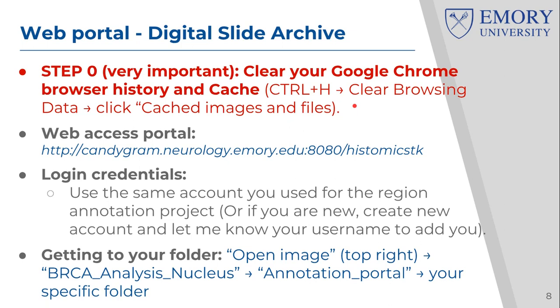The reason that is important is that, especially if you were with us during the previous version of this, the region annotation, then you will have annotation styles stored in your browser. You're going to have the old version of the Histomics TK and the digital slide archive interface, and these may really collide with the new updates. So this is very critical. Please make sure to do this before you go on and do anything else, okay?